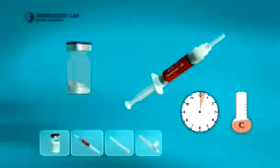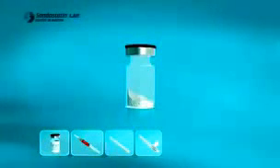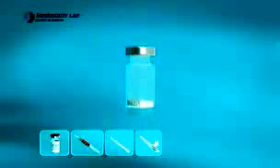Before handling the components, allow the Sandostatin LAR vial and pre-filled syringe with diluent to reach room temperature. This will take approximately 30 to 60 minutes. Wash your hands with soap and hot water, then place the package on a clean and flat surface. Remove the flip-off cap from the vial containing the Sandostatin LAR. Assure that the powder is settled at the bottom of the vial by lightly tapping the vial on a hard surface.